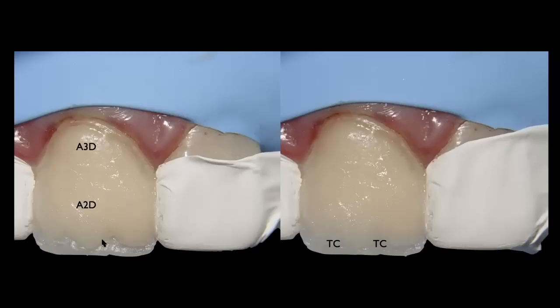Then starting right where the middle third and the gingival third meet, I start with my A2D, extending almost all the way down to the incisal third, literally almost all the way down to the incisal edge. I am short of the incisal edge maybe a millimeter, because remember, we have a white opaque line that we need to add in this area so that we can reproduce the halo effect between the mamelons that we had identified during our color mapping exercise. So as you can see here, I have placed that A2D body and I have developed all three mamelons.